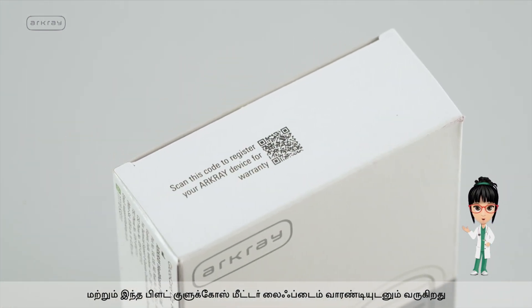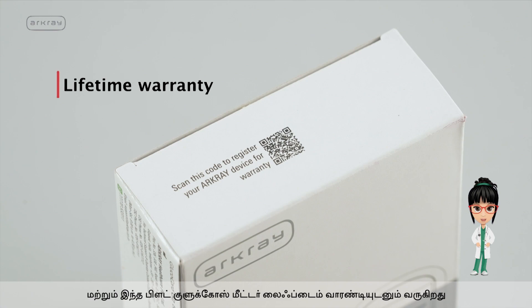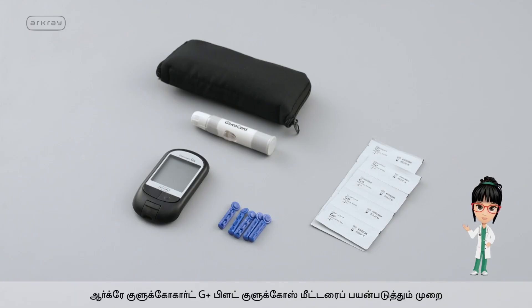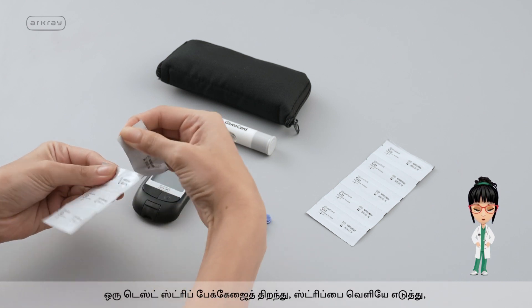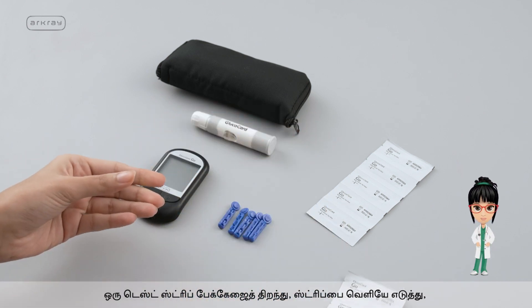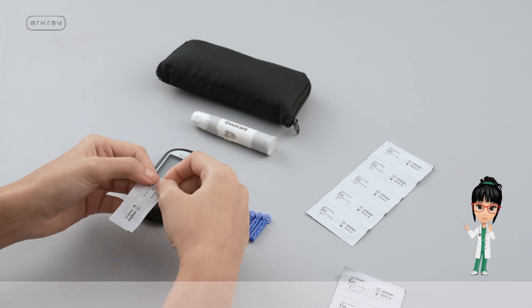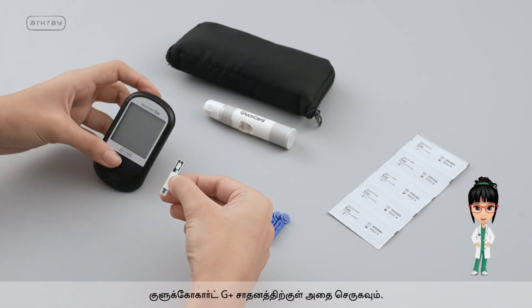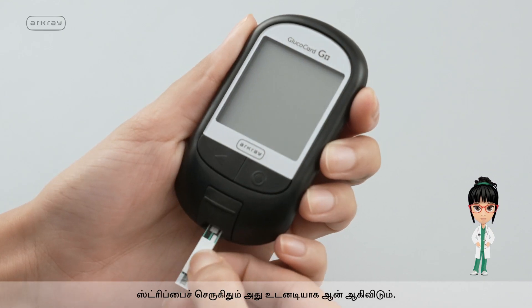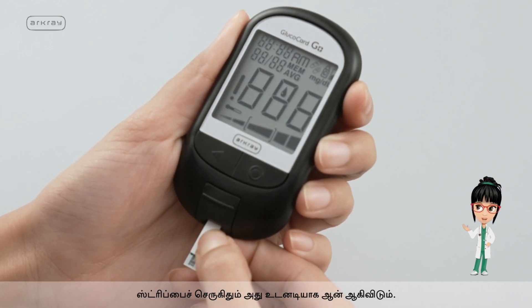This smart blood glucose meter also comes with a lifetime warranty. Here's how to use the R-Cray Glucocard G Plus Blood Glucose Meter. Tear open one test strip packaging, take out the strip, and insert it into the Glucocard G Plus device. It turns on immediately upon inserting the strip.